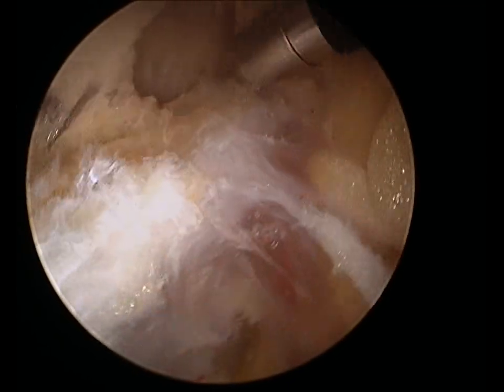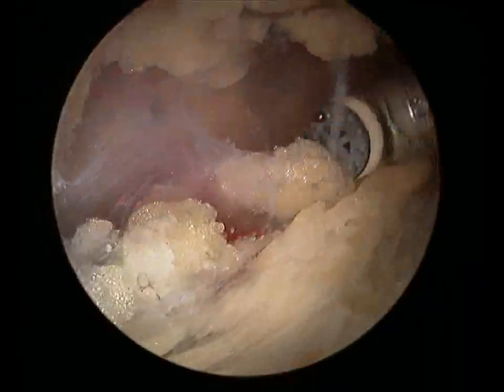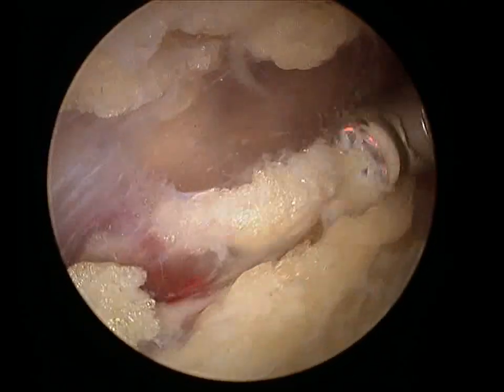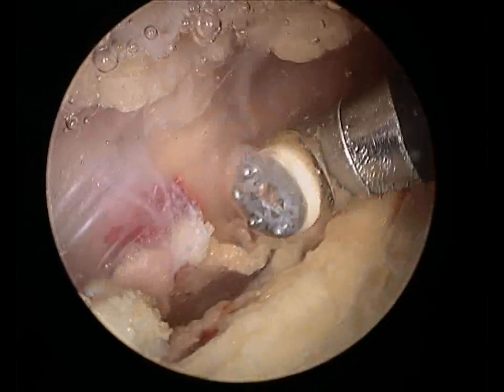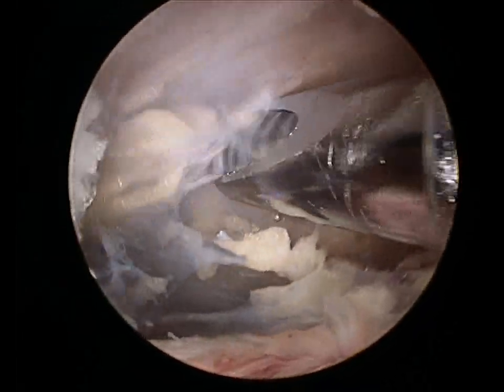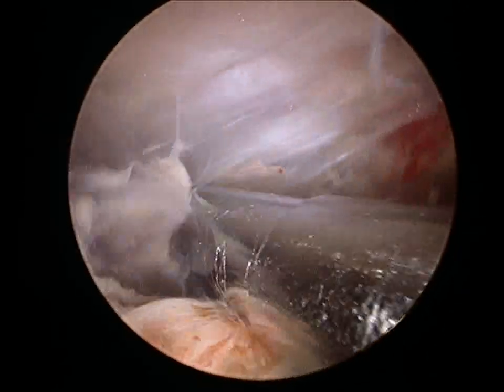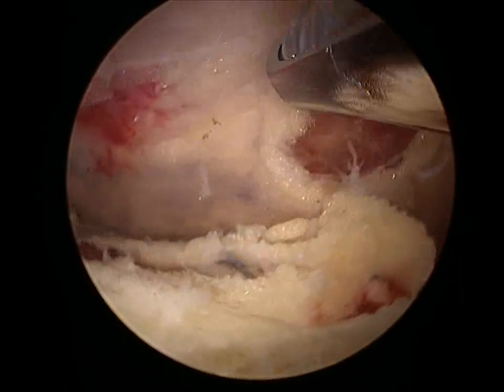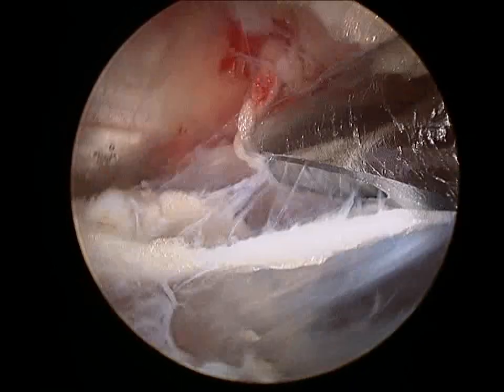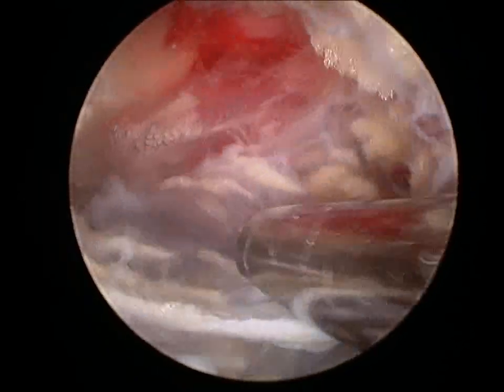Notice we're not disconnecting it — we're just splitting it. Now you can see this device is also being used to melt away the bursa. The bursa does have a little bit of fat in it, and this filmy white stuff is the bursa tissue that we're going to use this electrothermal ablation wand to basically melt away. We also use a motorized shaver, which will eat away the bursa where it's gotten inflamed. The bursa will grow back — it just doesn't grow back inflamed now that we've taken care of the pressure phenomenon with the fascia lata.